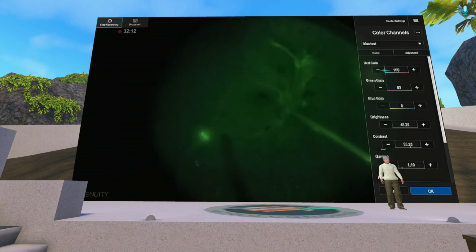Okay. I tried LED with the given wavelength. It seems that the separation of the wavelength, at least on the source that I tried, was not so good compared to the optical filter.